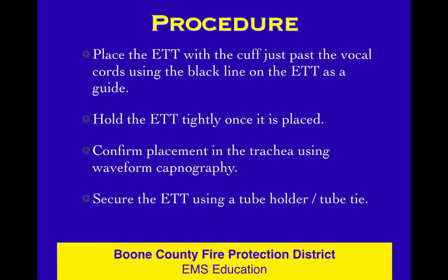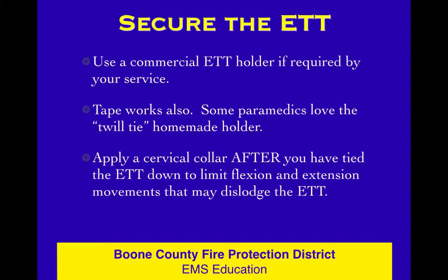Place that cuff just past the cords using the black line as a guide. Hold it tightly — don't give it up. Confirm placement using capnography, then tie it down. Come back and adjust if needed after you listen.